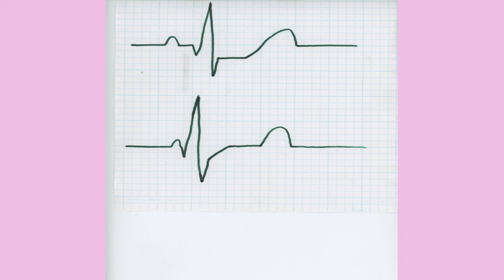Now, again, these are not actual millimeters because it's enlarged, but if you were reading an EKG, it would be 2 millimeters. So 2 millimeters of ST segment depression. The slope of this is from the J point to the 2 boxes past the J point, and it's horizontal in this example. So if you go back to the criteria, then you have, in this case, 2 millimeters of horizontal ST segment depression, and that would be positive for ischemia because you're 1 millimeter or more of that.